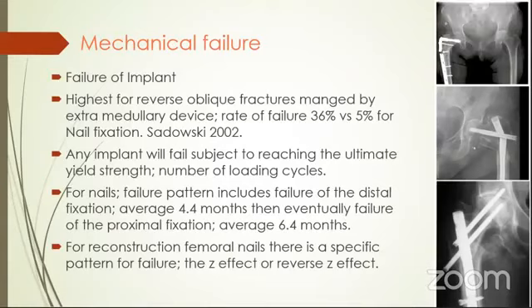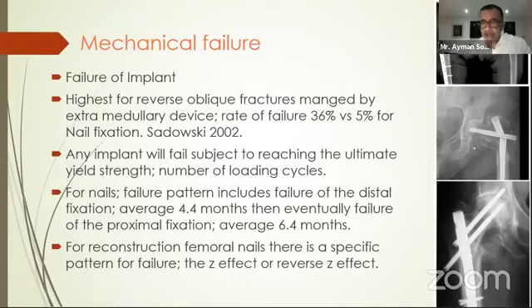There is a particular failure pattern with nails. Always, if you've done an intramedullary nail, look for your distal fixation, because normally the distal fixation would fail before the proximal fixation. They sort of autodynamize themselves, so bear that in mind.